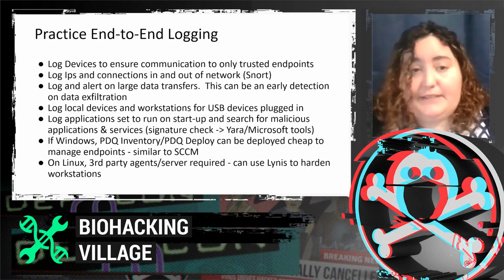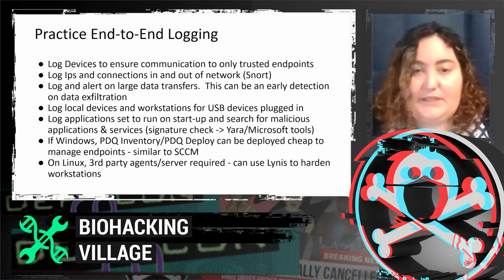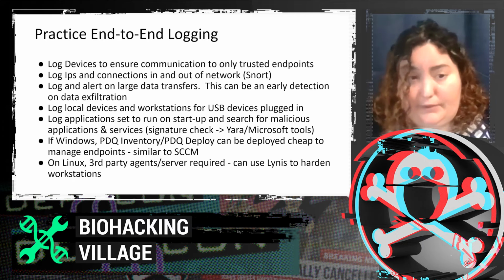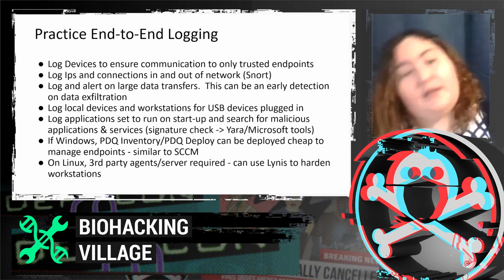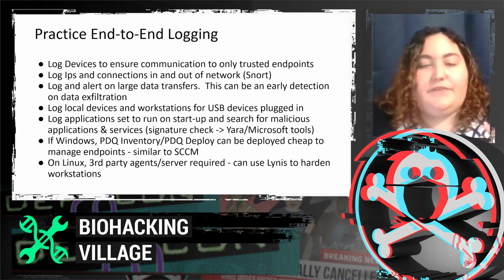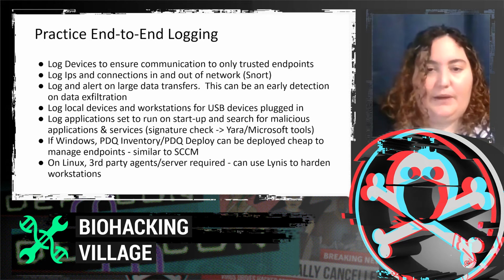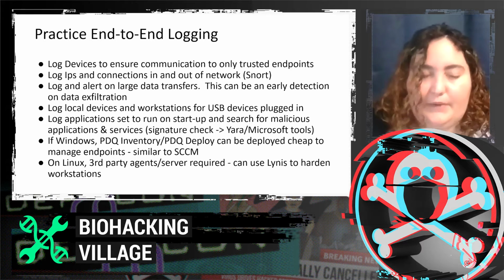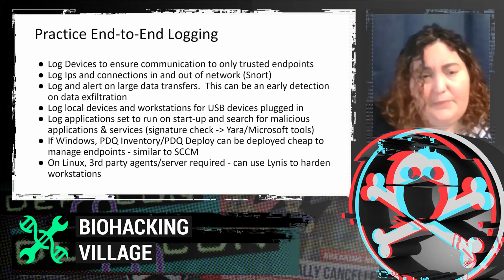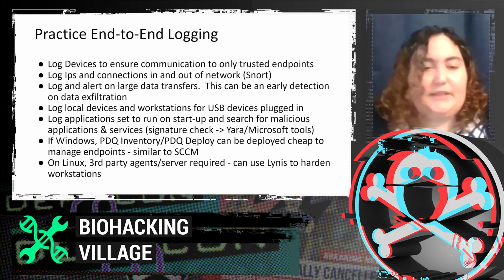So you're going to log devices to ensure communication to only trusted endpoints, log IPs and connections in and out of the network, and log and alert on large data transfers. You're going to want to log local devices and workstations for USB devices that are plugged in. You're going to want to log application setups to see what's running on startup. You're going to want to search for malicious applications or malicious services.